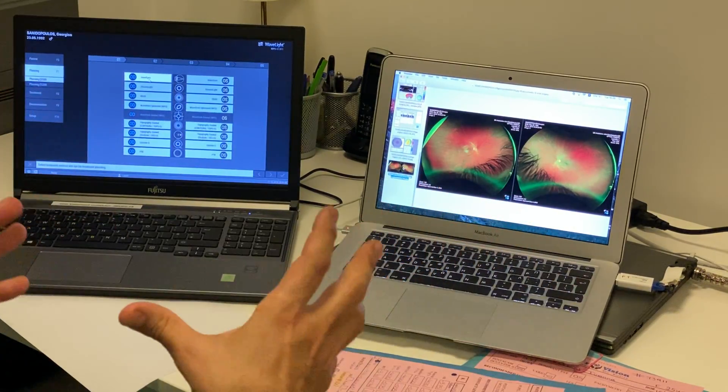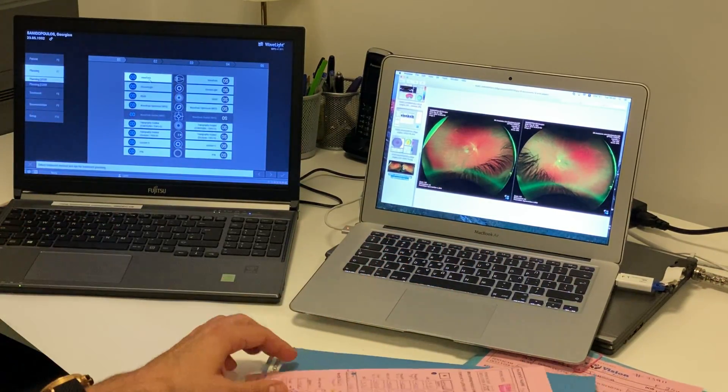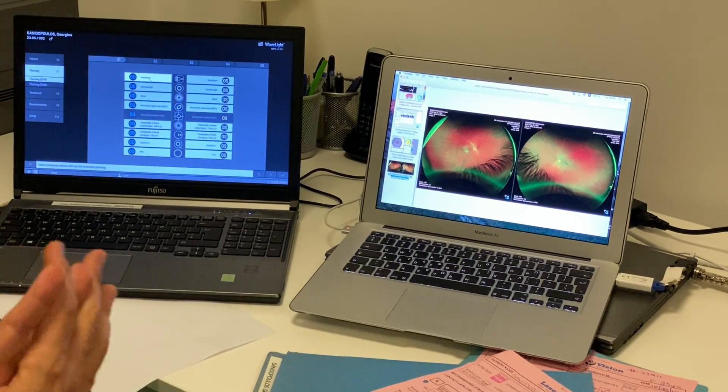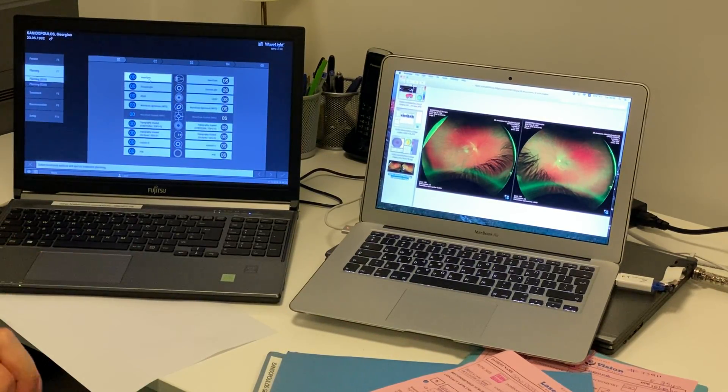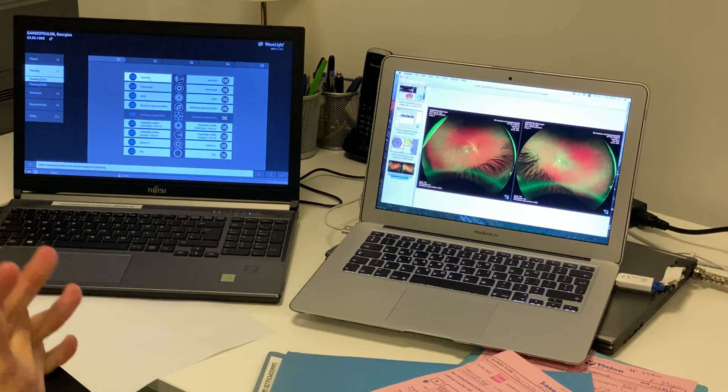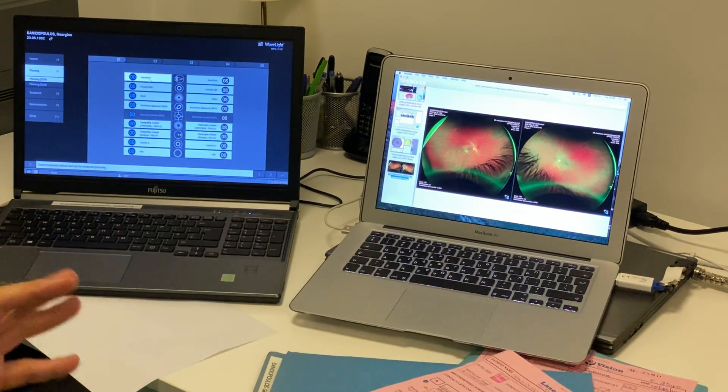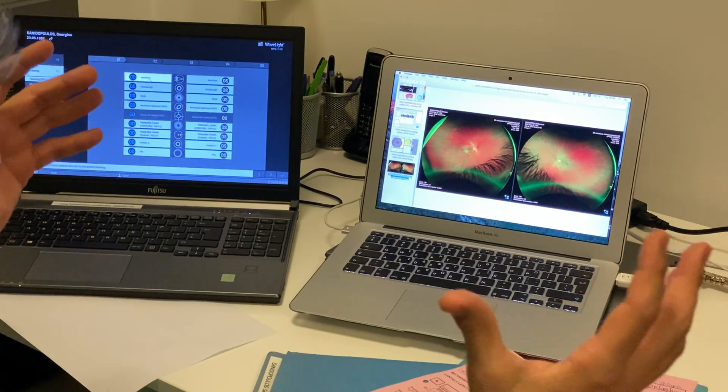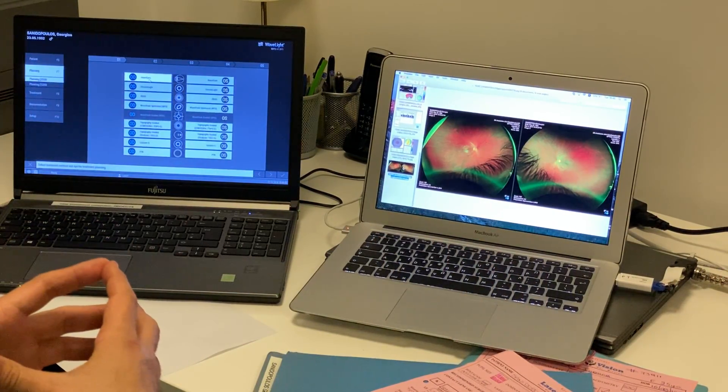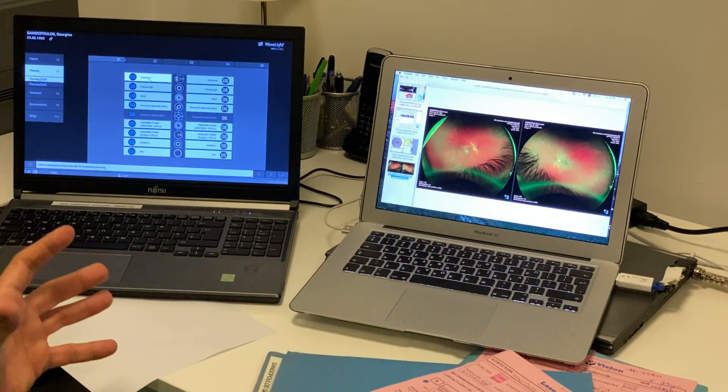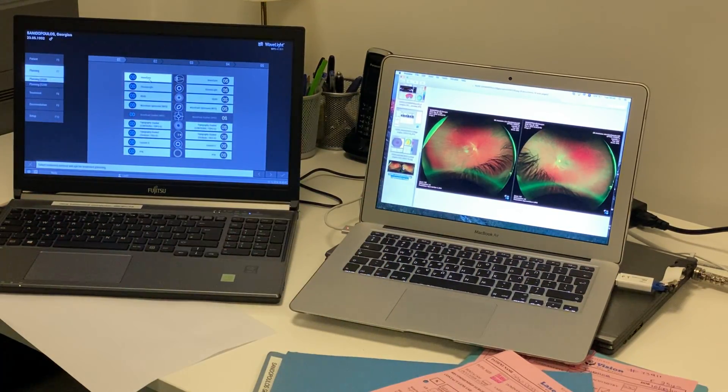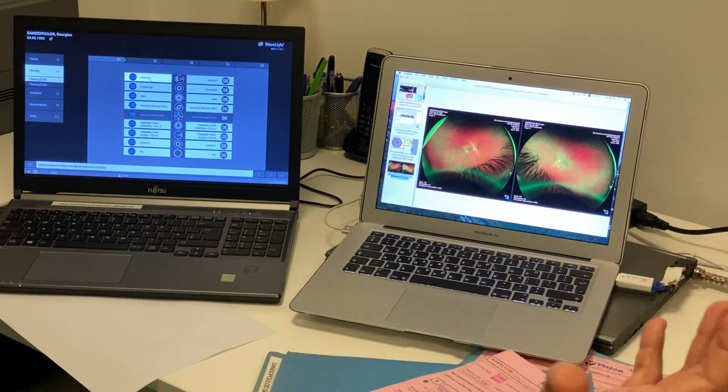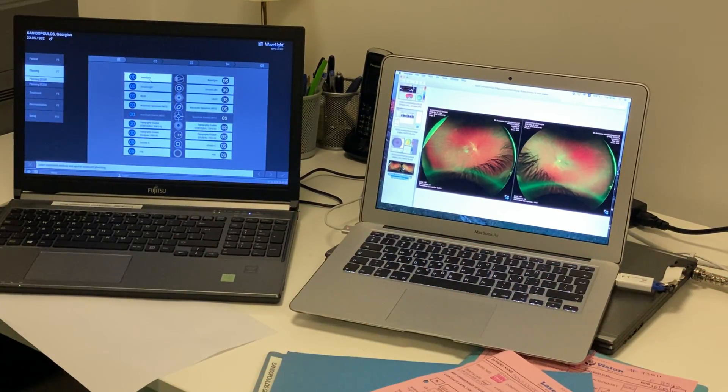Now, these separate diagnostic devices, and we also have wavefront measurements here. In this particular patient, the wavefront was minus 3.7 minus 0.75 at 161 degrees. So these were individual measurements that we set into a lab-like fashion. We tried to correlate between them to do a TMR, a topographic modification of the refraction, an entity that we introduced five years ago.